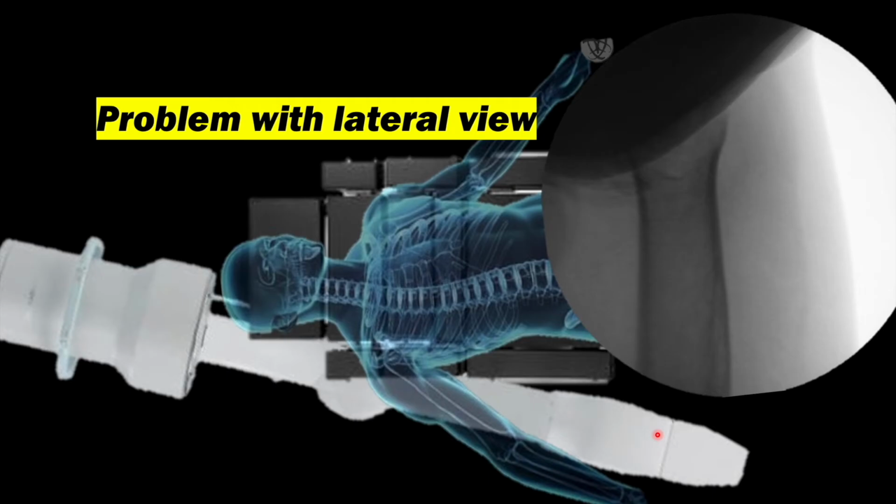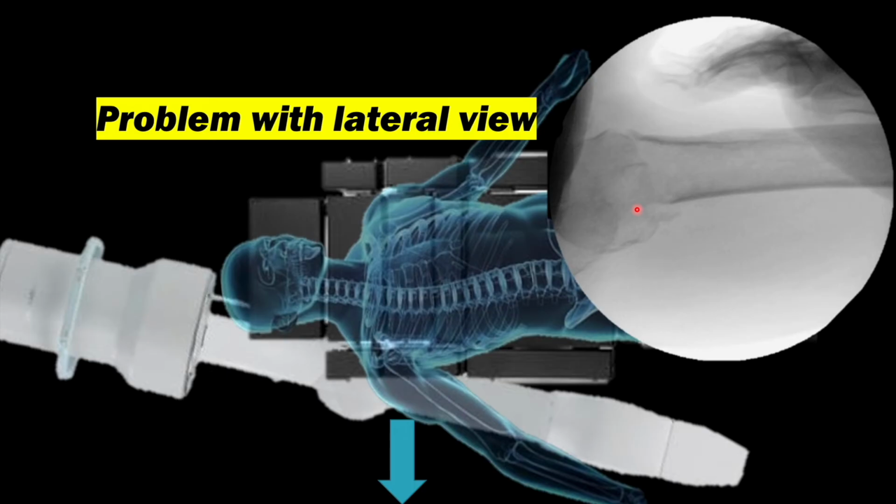So we have to rotate it like this, and the whole of the operating part of the C-arm should lie on the head end. But again, you see some problem is there. Why? Because the head of the patient is obscuring the view, because it is coming in line with the shoulder. So what we can do, we can either tilt the head away from the operating side after telling the anesthetist. They can position the patient's head accordingly, and we can slightly pull or lateralize the proximal humerus in this direction, like this.